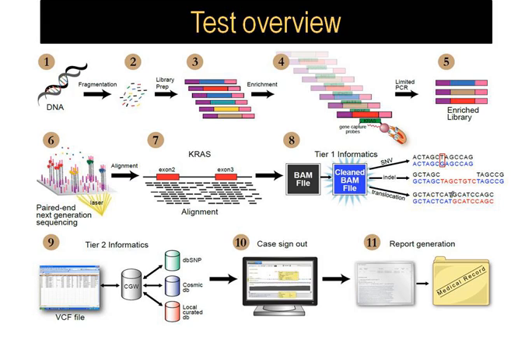And then we have our in-house developed bioinformatic software which then would put it all together for us in a very user-friendly browser, and then we generate the report which goes into the medical record.